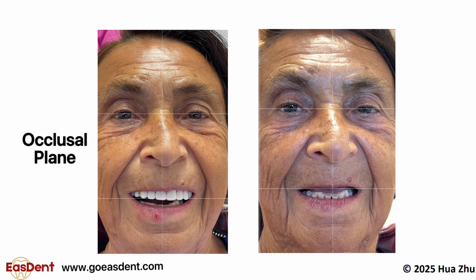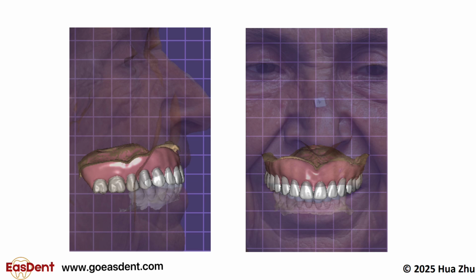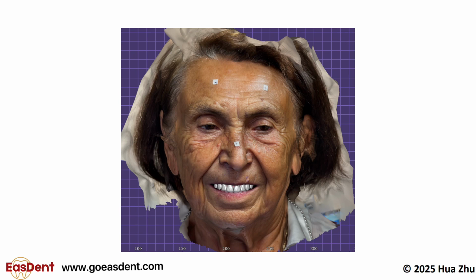Evaluate the occlusal plane on both the Easdent tray and the opposing arch. Determine which one provides a better occlusal angle and select it as a reference plane. If needed, instruct the lab to adjust the occlusal plane according to the reference plane. The incisal edge generally determines the height of the occlusal plane and the buccolingual position of the anterior teeth. Denture tooth setup is guided by the opposing teeth and aesthetic considerations.